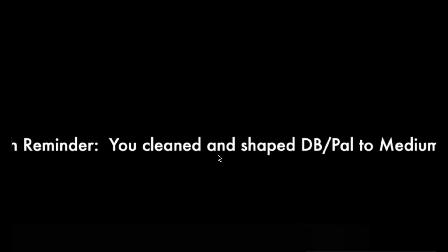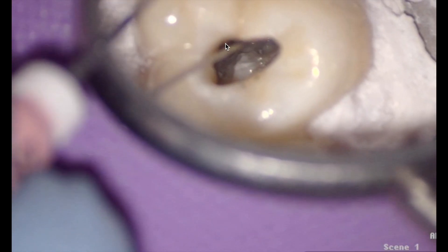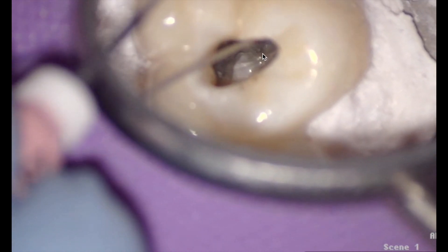So this is my reminder in the middle of the video as I was editing it. I know exactly where my mesial buccal, distal buccal, and palatal canals are — it's still vital. So let's get some sodium hypochlorite down there and dissolve the vital tissue. I actually didn't know where these two canals were, but you can see them right here — there's MB1 and there's MB2. I saw those after we cleaned it all out. So I opened the distal buccal to a medium 3506 and the palate to 3506, using full-strength sodium hypochlorite.